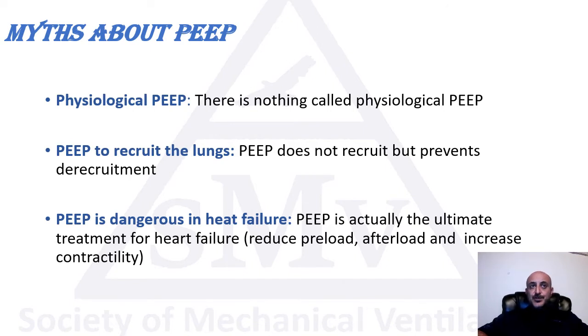Sometimes I also hear, let's apply PEEP to recruit the lung. And remember, recruitment of the lung is an inspiratory phenomenon. PEEP is only an expiratory phenomenon, at the end of expiration. So you cannot recruit with the PEEP, but PEEP prevents de-recruitment of the alveoli.